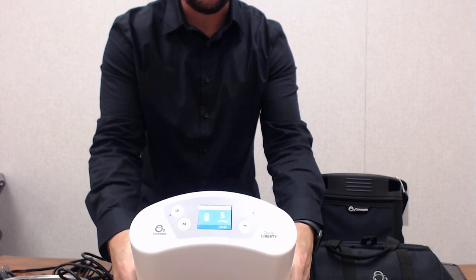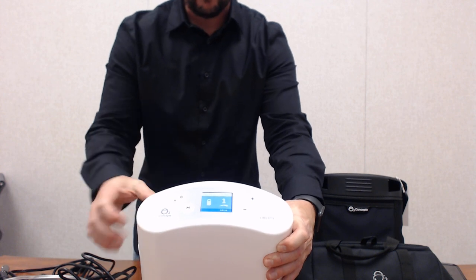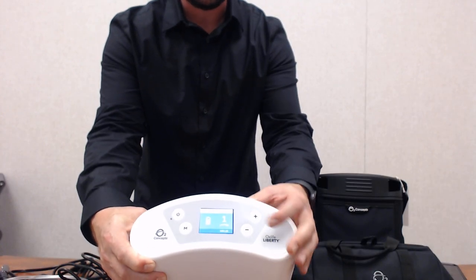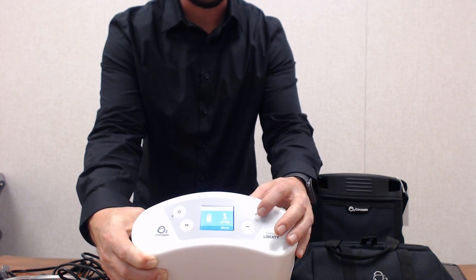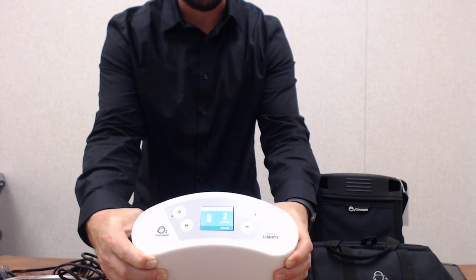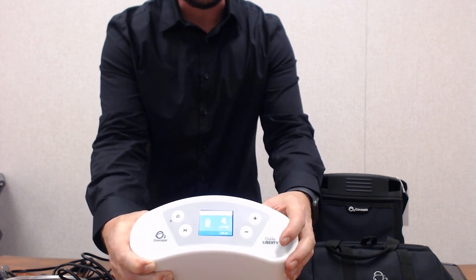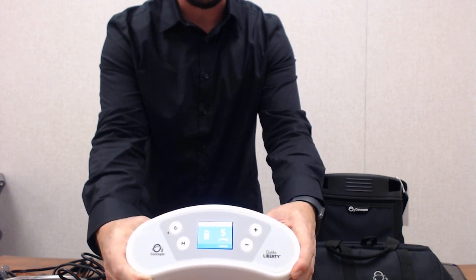Continuous flow goes from settings one through five. Every time you go up on a setting you increase the liter flow. On setting one we are at a half liter continuous. There is a plus and minus option to increase or decrease the flow. Setting two is 0.75 liters per minute, setting three is one liter, setting four is 1.25 liters, and setting five — the max — is one and a half liters continuous flow.